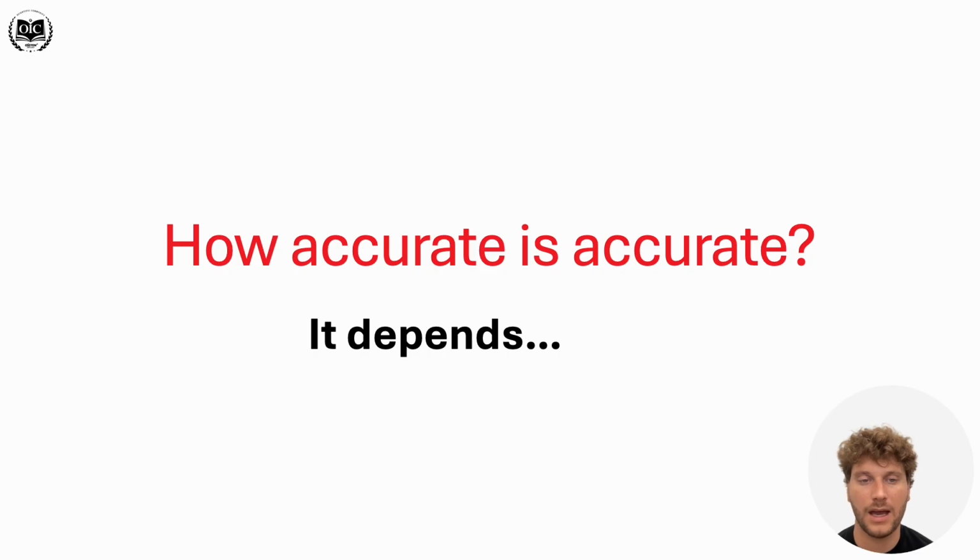And if this is converting the patient from the removable denture to the nice looking temporary prosthesis after oral surgery, after placement of the implants, then I can deal with even a few hundred microns of discrepancy, adjusting it to the satisfactory level, but knowing that I can deliver the patient the prosthesis maybe in a few hours after the surgery, and he can leave the clinic with functional and good-looking teeth on the implants.